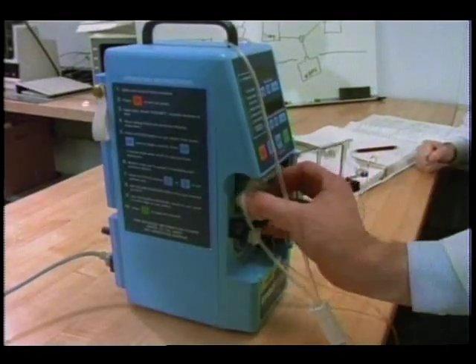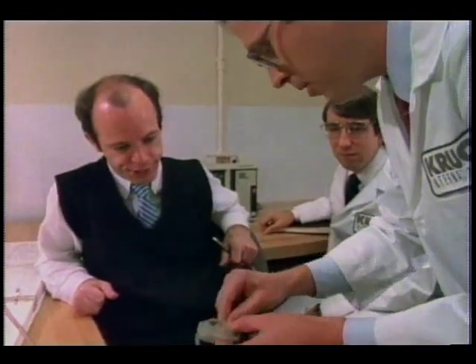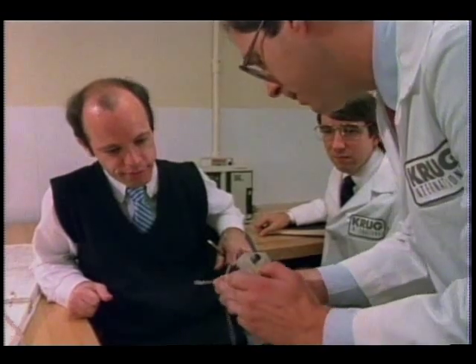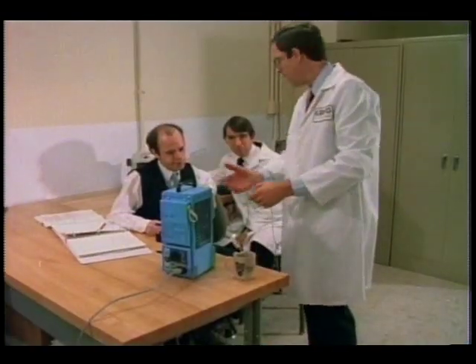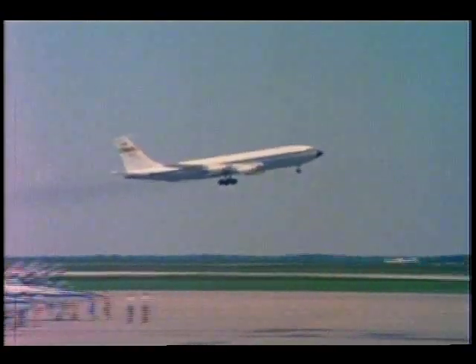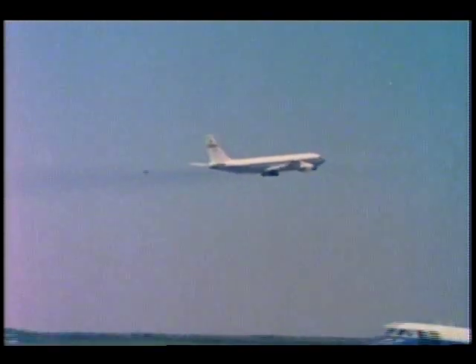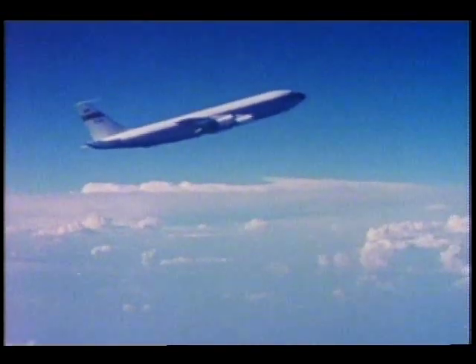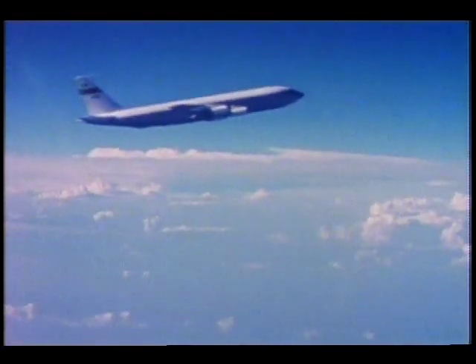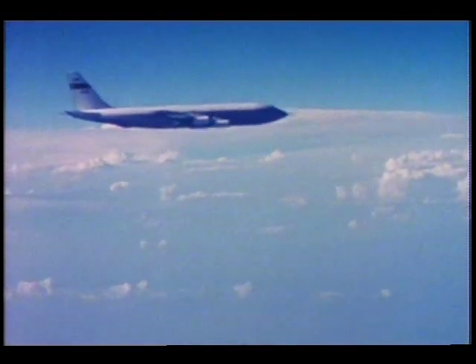In building the HMF, current off-the-shelf equipment will be used as much as possible. However, existing technology must be adapted in order to operate in microgravity and conform to space station weight and size constraints. The KC-135 provides a testing environment for equipment and procedures to be used in space. Using a parabolic flight path, the KC-135 can simulate weightlessness for a few valuable seconds.